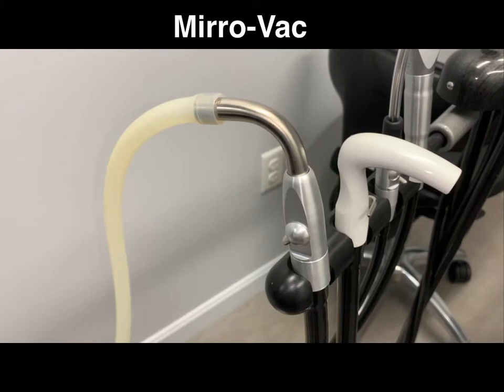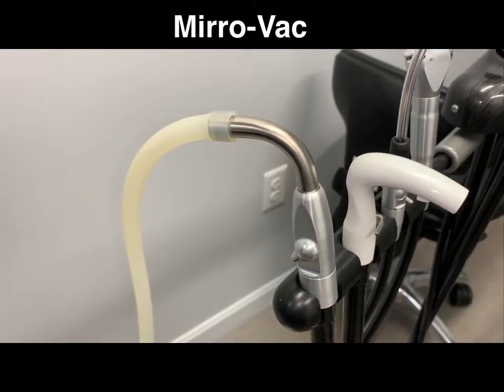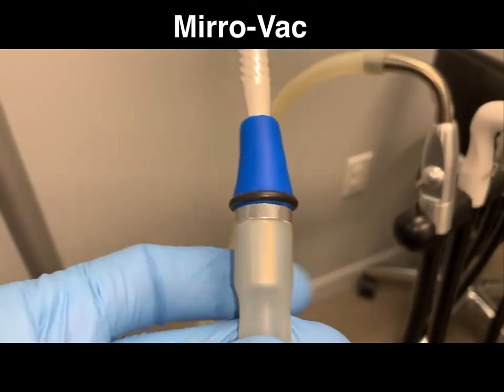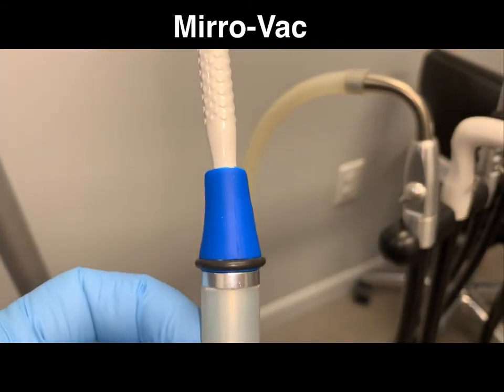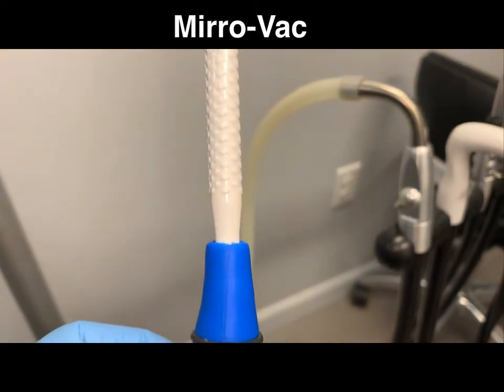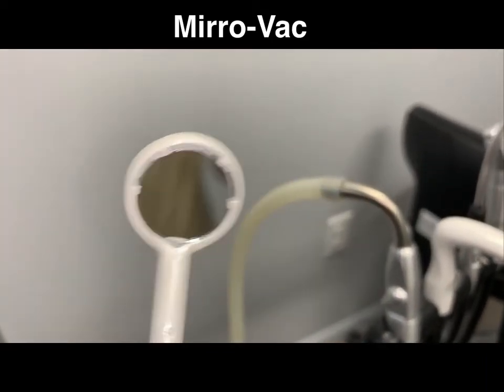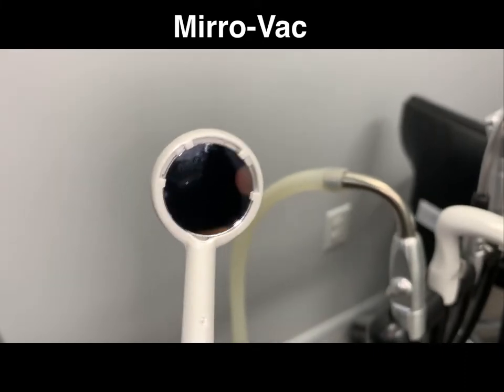Alright, so this is the Mirro-Vac. Again, I'm using the same tubing for better suction. I'm using the same adapter and rubber tip. This one has holes in the front. It's got holes on the side a little bit, and then holes in the back.